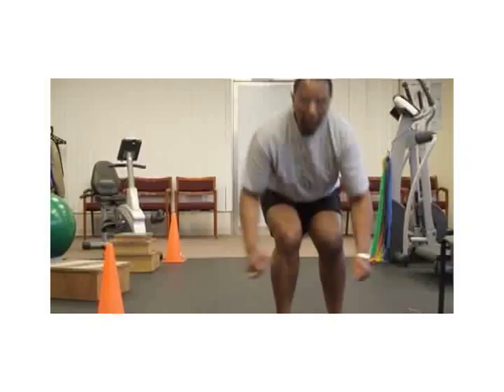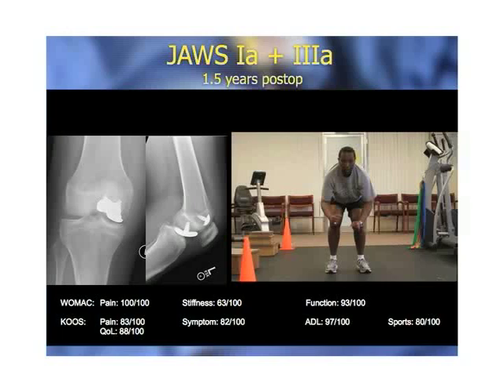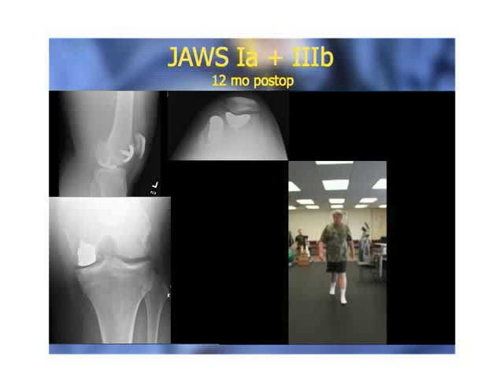He's about at a year and a half post-op, and we actually scored him just prematurely, and he did pretty well. Pain scores were good, functions were good. Stiffness has been a consistent issue, I would say, but that seems to get better with time, and those were subjective scores. This is a gentleman, another example of one of the combo lesions that we treated.